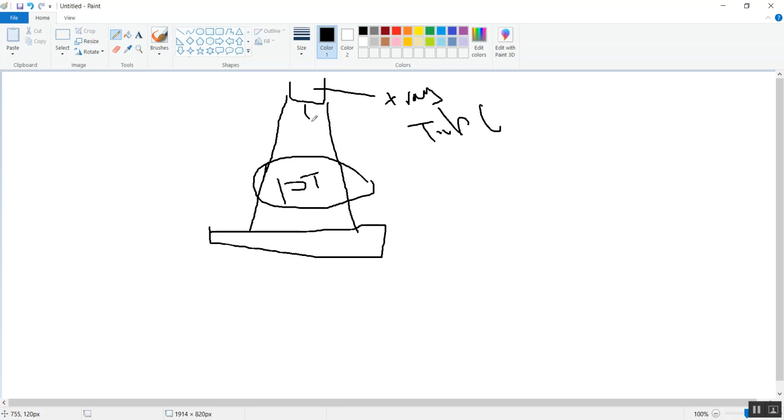Some of the X-ray photons incident on the patient are absorbed by the patient, okay. These photons have energy.